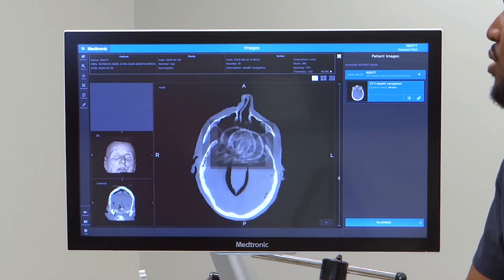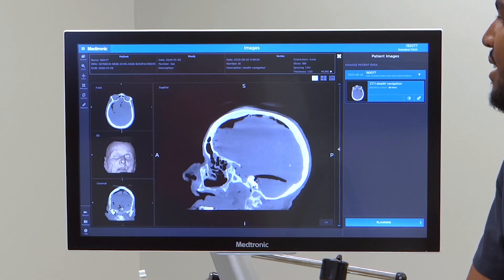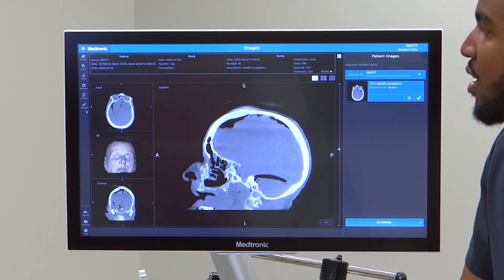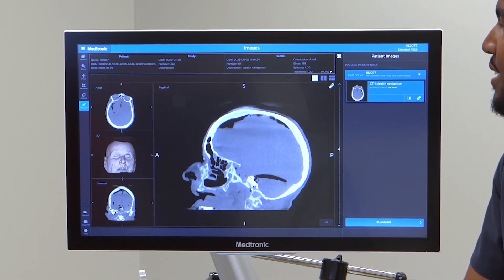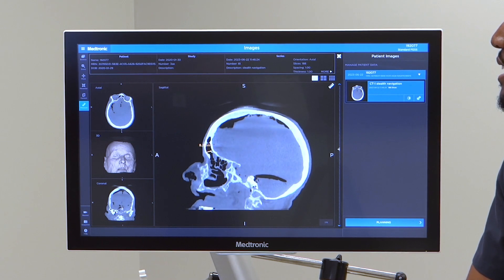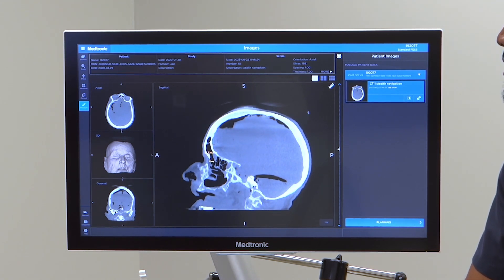Various features to point out on the side include the measure tool. If you click that, you can click and drag to measure anywhere in the anatomy that you'd like to measure.